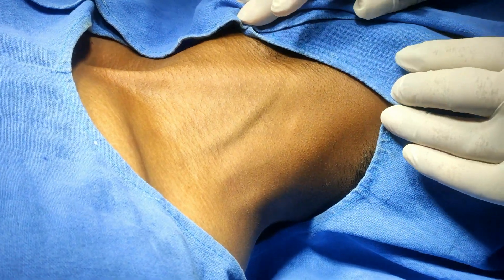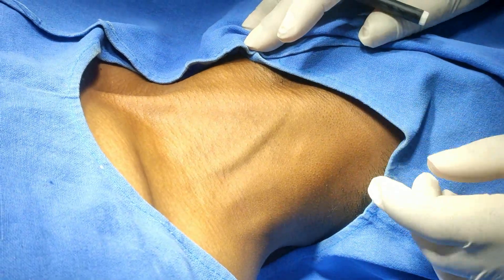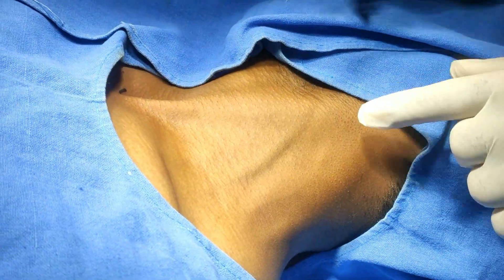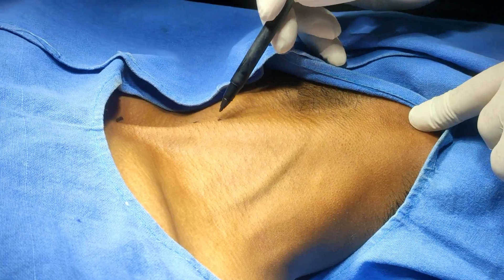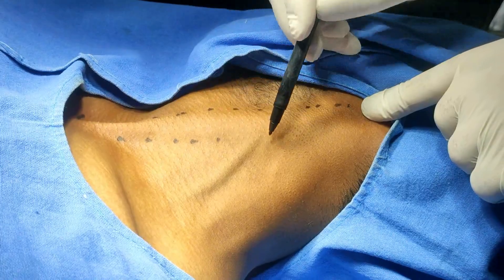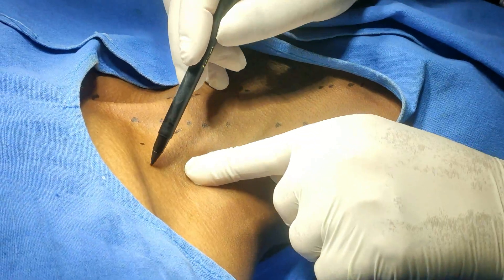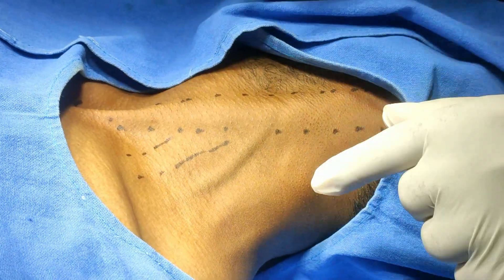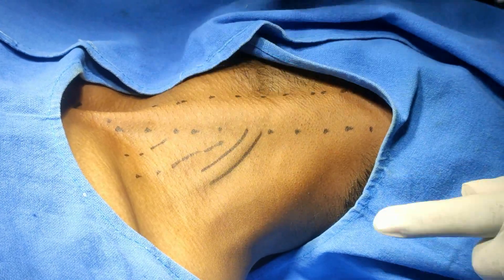This is a 20-year-old technique and I am giving the left-sided brachial plexus block with my own technique. I am marking the suprasternal notch here, I am marking the sternocleidomastoid muscle going up to the mastoid process. This is the sternocleidomastoid muscle, this is the clavicular head, and this is the external jugular vein here.